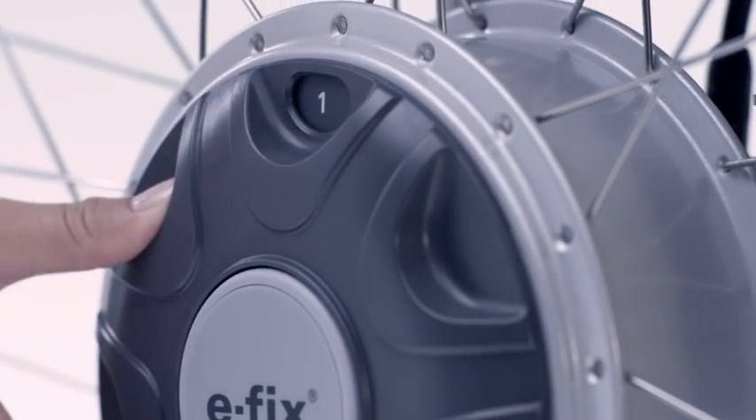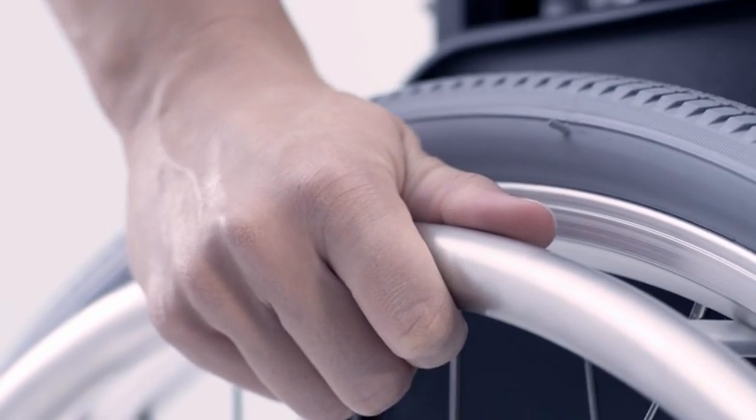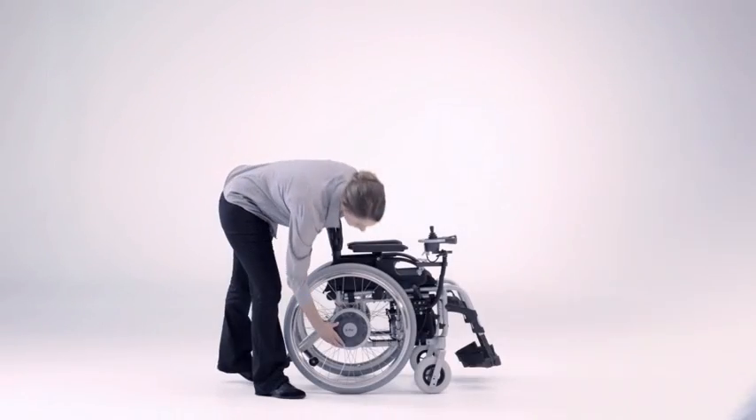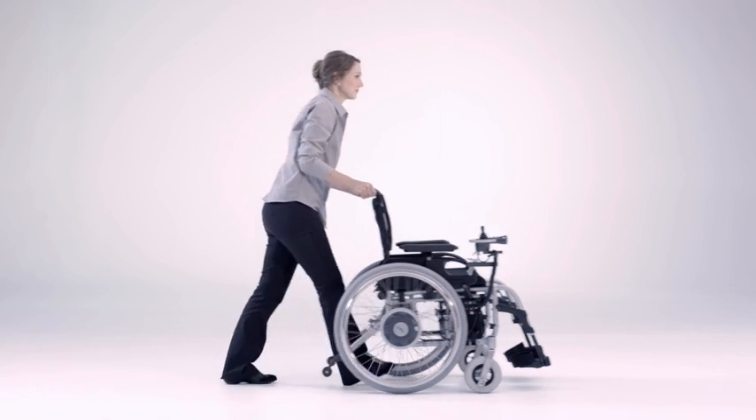The drive wheels are very easy to couple up or uncouple, so you can push by hand if you wish. Or your carer pushes the wheelchair using the handles.